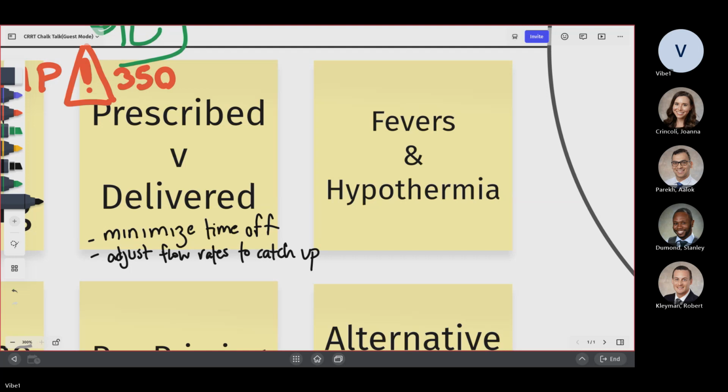That's why the literature now, I don't know about recently, but the last I knew, they were preferring to use double ports instead of trialysis.